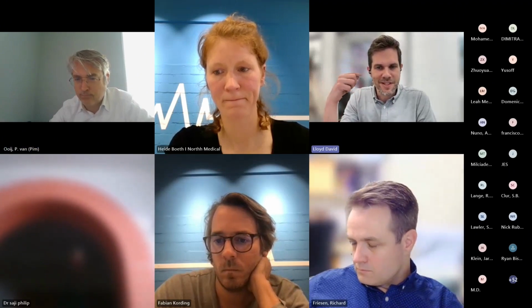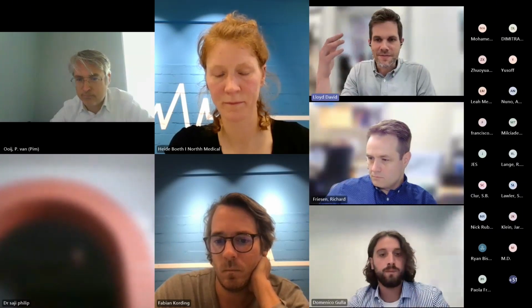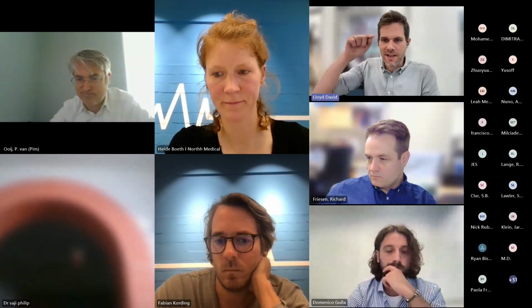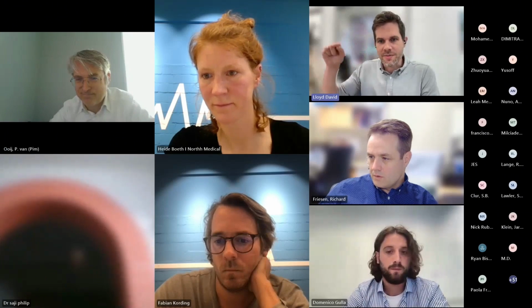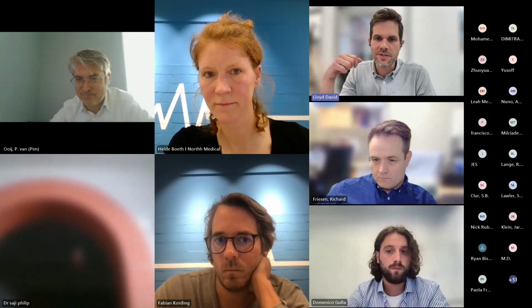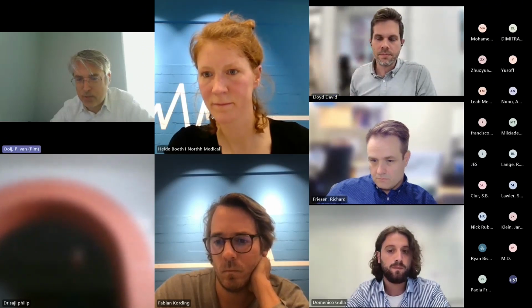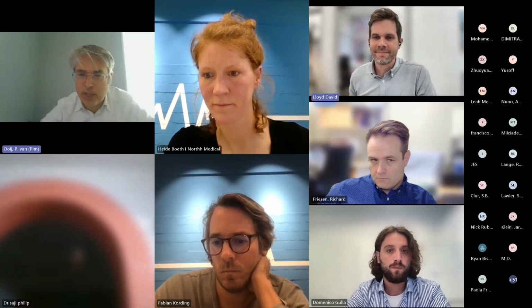So there's a genuine improvement, if you like, or it's more satisfactory to be looking at images without sharp edges and lines when you're looking at small vessels, but it's probably not actually improving the resolution much beyond your in-plane resolution that you put in. Yeah, so for the through plane, I totally agree.